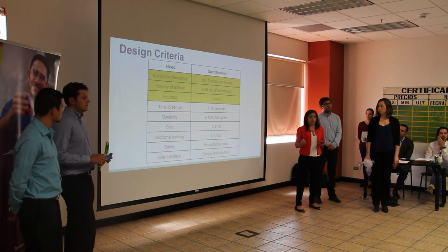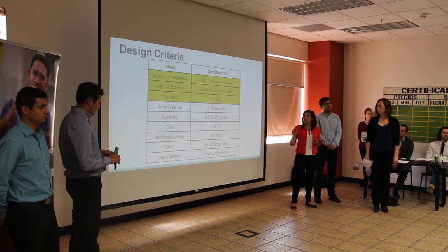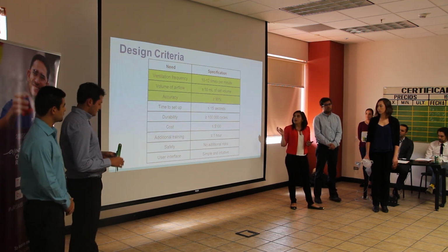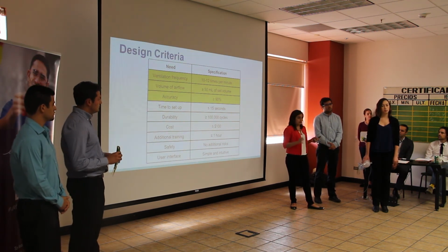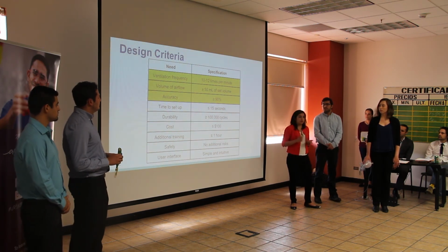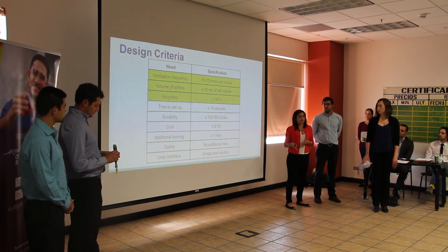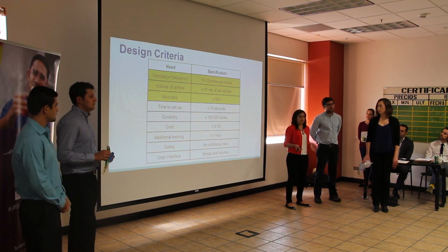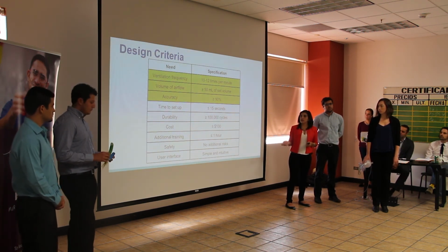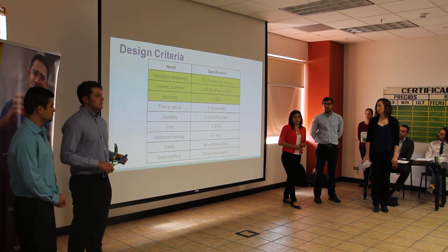In the volume, that, as my partner said, is measured by the weight, we wanted to be within 50 milliliters of the set volume established for each person. And the accuracy of both of them, we want accurate ventilation frequency and accurate volume of airflow to be sure there are not any complications, and it has to be greater than 90%.